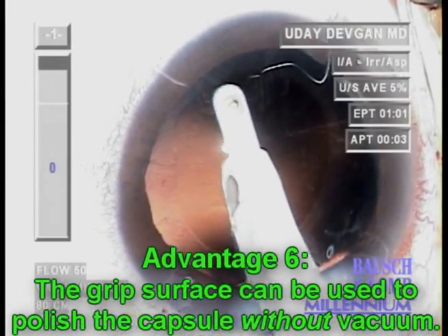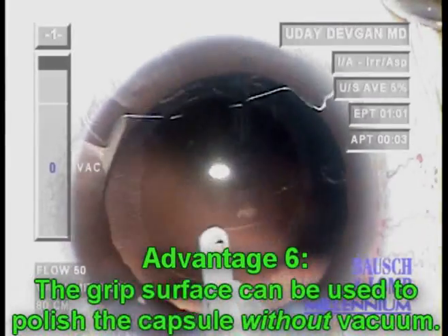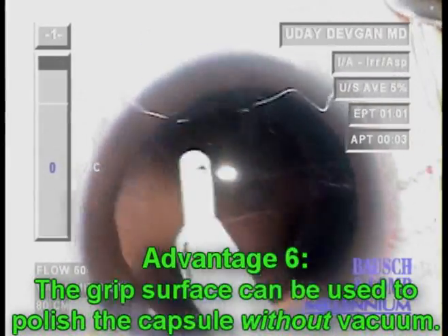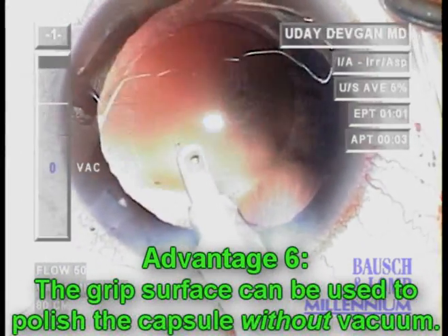We can also use this surface to polish the posterior capsule without the use of vacuum. Even here, with no vacuum, we'll clean the capsule and you'll see it's completely clear of any debris.